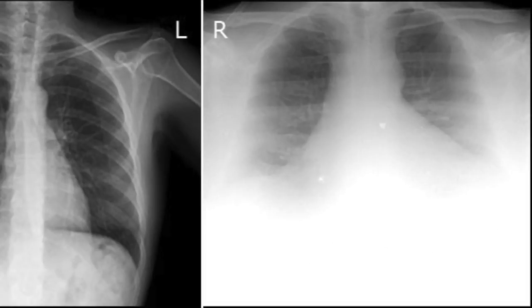Because of the evidently greater attenuation in larger patients, when using techniques designated for average dimension patients, the technical exposure factors will need to be increased. We would most probably increase mAs for moderately larger patients, but for more disparately large patients, most of the radiation will be absorbed in the subcutaneous fat, which is the main reason our technique must be adjusted accordingly, and an increase in the kV may be mandated.